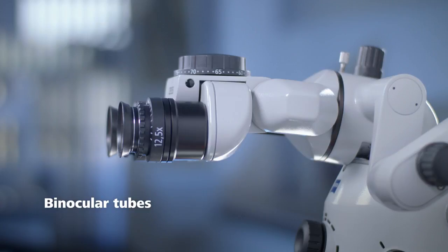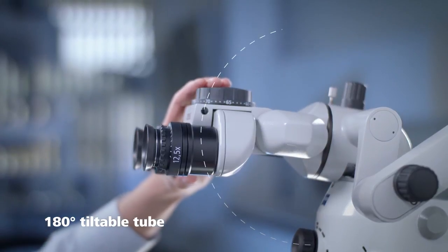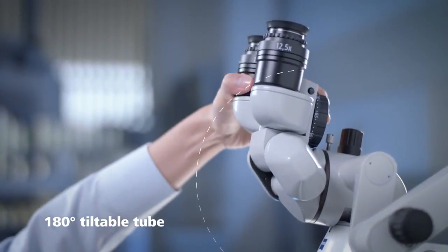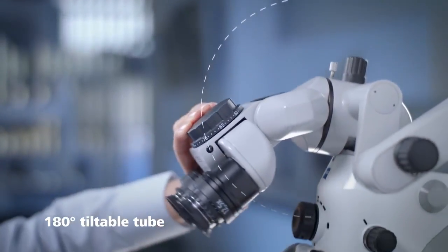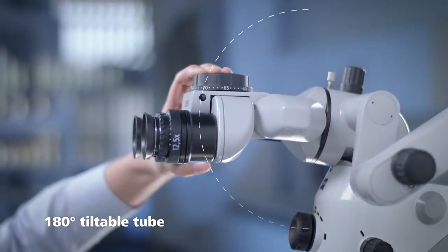Zeiss offers two binocular tubes: a 180 degree tiltable tube and a foldable tube F170-F260. Your choice of binocular tube depends on your needs and preference. The 180 degree tiltable tube enables you to adjust the eyepieces for a relaxed and ergonomic working posture by tilting it at any angle between 0 and 180 degrees.